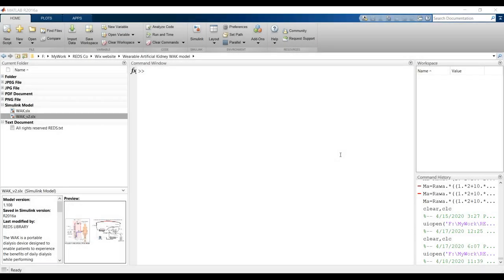Hi everyone. Today we have the next lecture about the artificial kidney model. This is the second version of the same model — this is version one, and this is the updated version two.